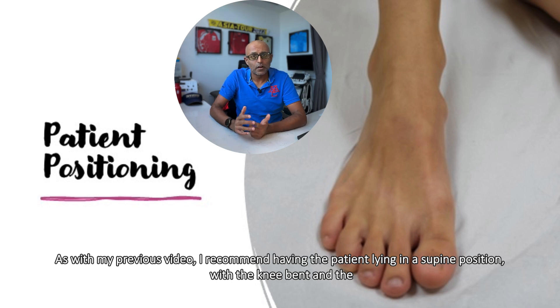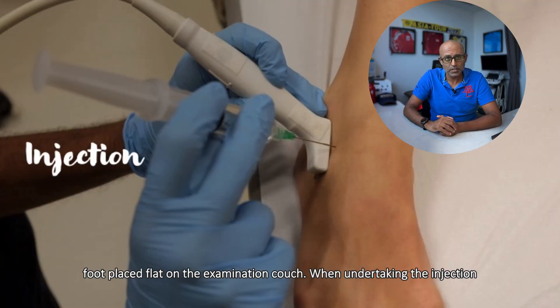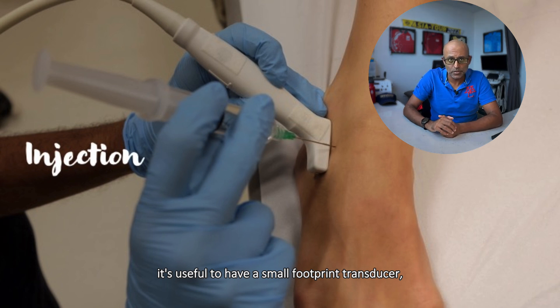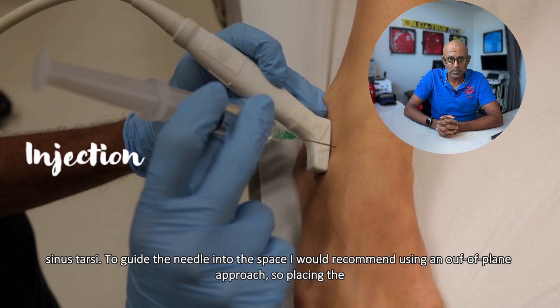As with my previous video, I recommend having the patient lying in a supine position with the knee bent and the foot placed flat on the examination couch. When undertaking the injection, it's useful to have a small footprint transducer. Place it across the sinus tarsae and you should see the talus and the calcaneum in view, and in between will be the sinus tarsae.